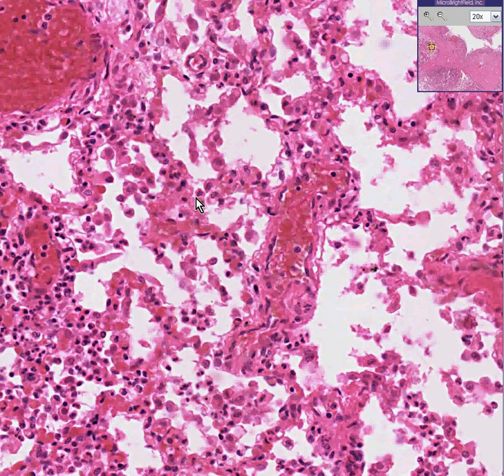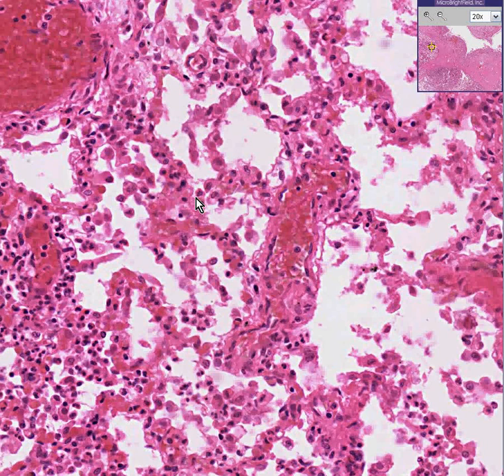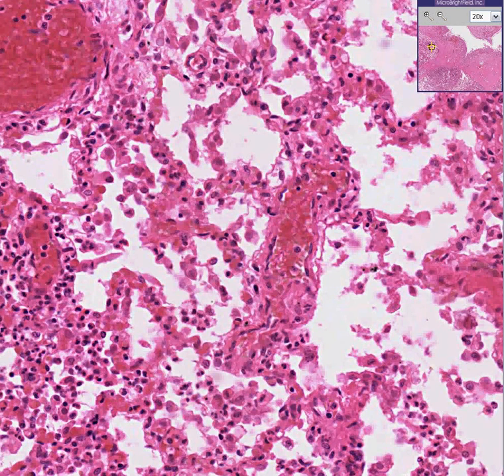This is from a bronchopneumonia. Bronchopneumonias are called bronchopneumonias because they generally start out in the bronchi. Lobar pneumonias generally start in the alveoli and can involve a whole lobe of the lung. But bronchopneumonias start out in the bronchi and bronchioles and eventually spread to the lung. Any type of pneumonia, if severe enough, can cause a well-defined pus pocket called an abscess, and that's exactly what we're dealing with here — a bronchopneumonia severe enough to cause an abscess.